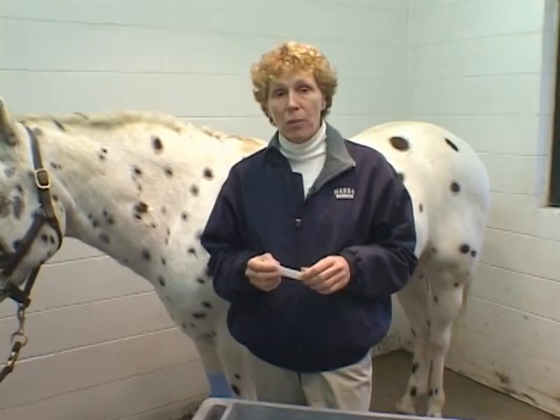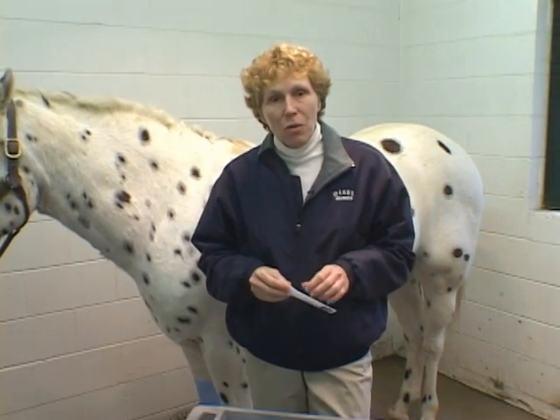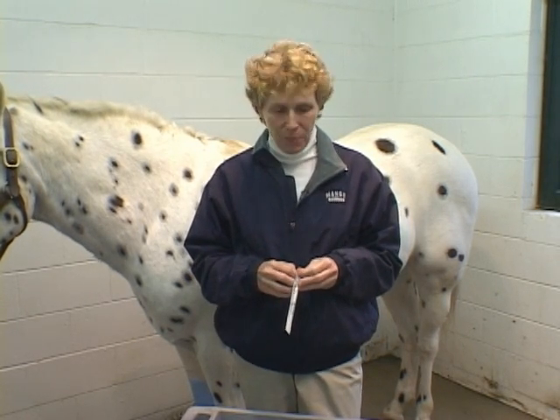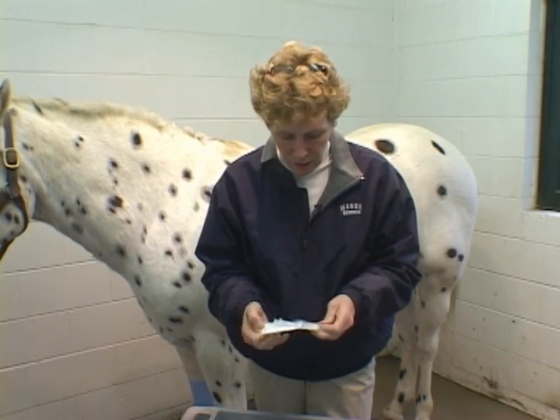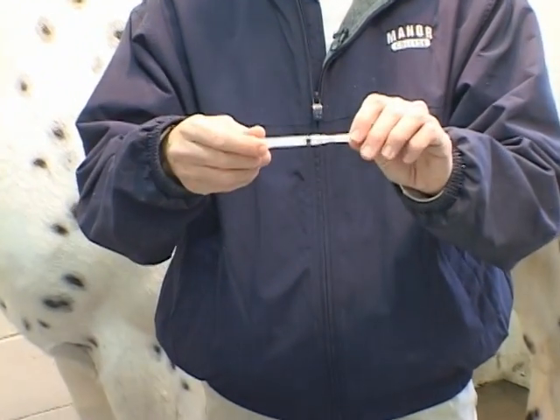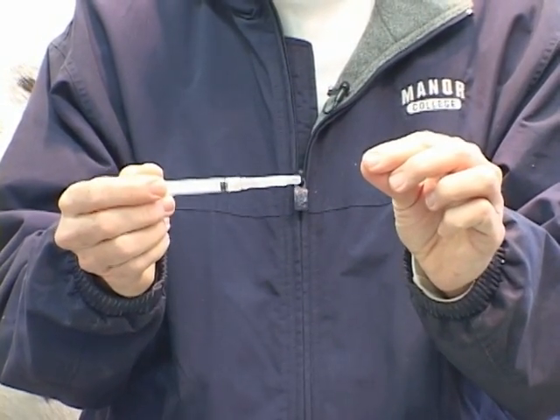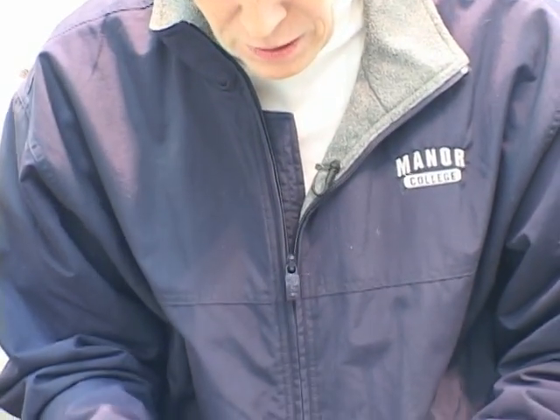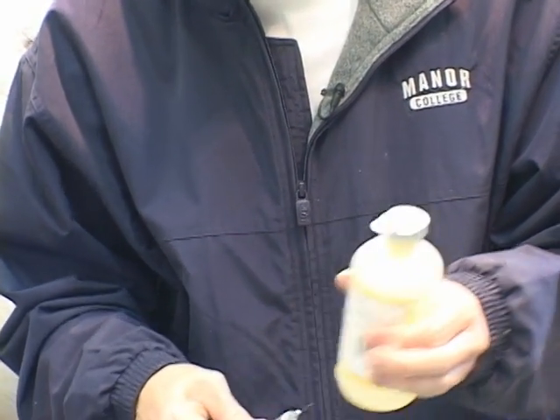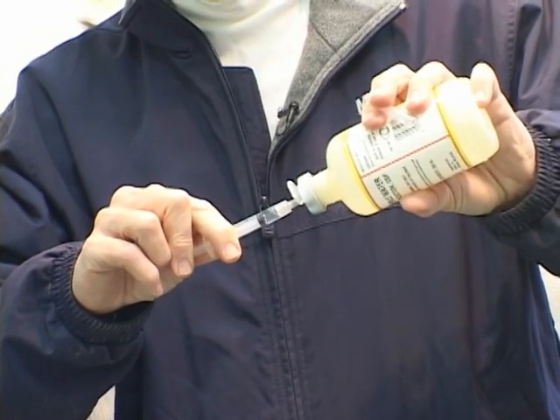Vaccinating horses is a big part of equine practice. So Checkers has very kindly volunteered to get a shot today — we're just going to use sterile water, which would be sort of the least invasive thing to do for him. I'm going to go ahead and open up my needle and syringe. They come packaged together; the needle's attached to the syringe. This is a twist-on top, so it actually screws on and off. I'm going to take my alcohol swab, swab off the end of my bottle, and draw up about one ml of water, which would be sort of like mocking up doing a vaccination.